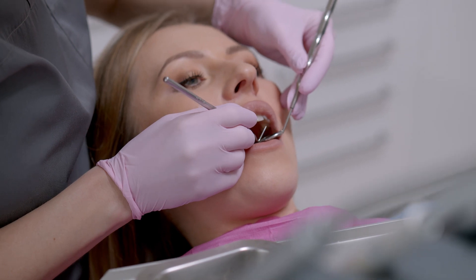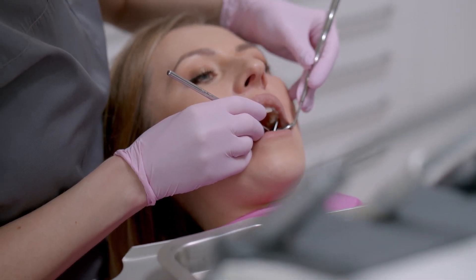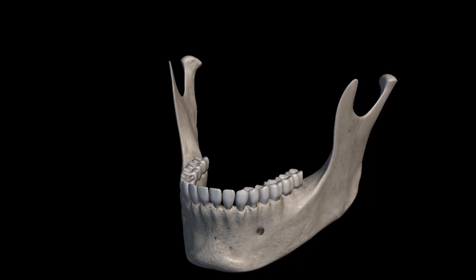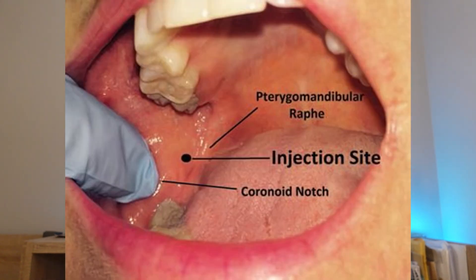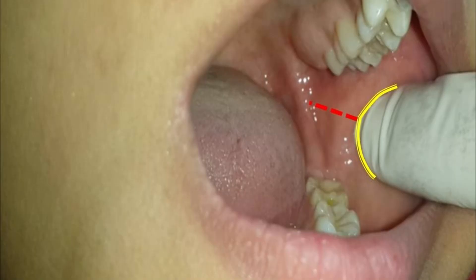Landing the blocks most of the time really comes down to identifying your landmarks. With the ID nerve block there are two important landmarks: a bony landmark and a soft tissue landmark. The bony landmark is the coronoid notch of the mandible — that's where we're going to place our thumb. Where we place our thumb determines the height we're going to inject at, because you draw an imaginary line in your head as to where that bisects along that depression to show you where the injection has to be.